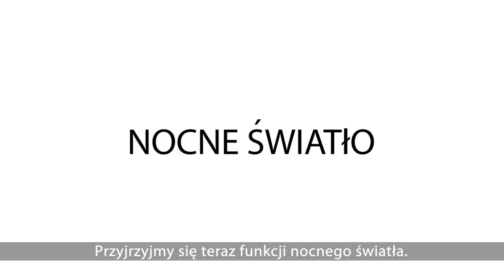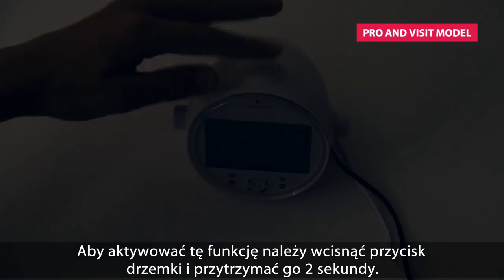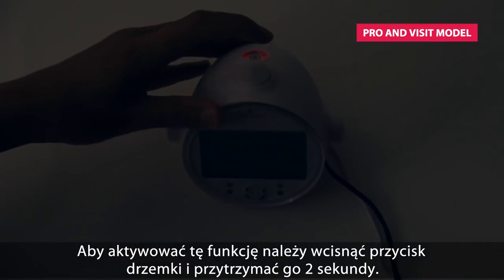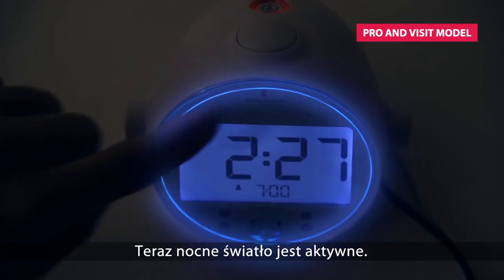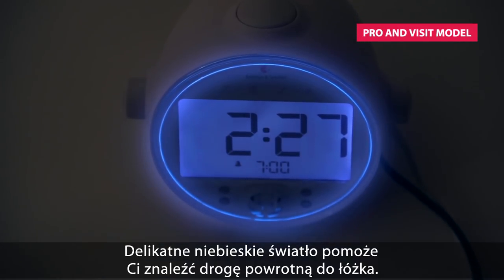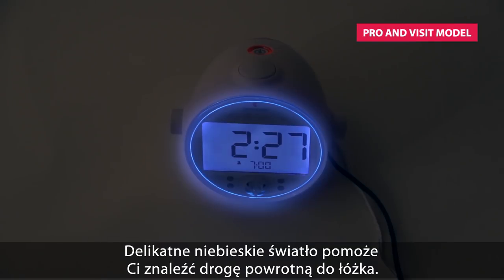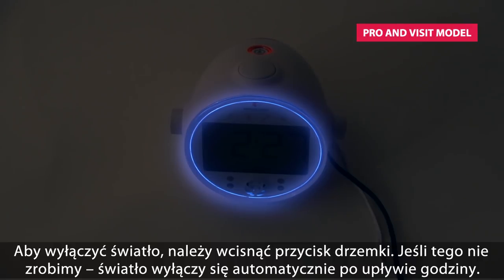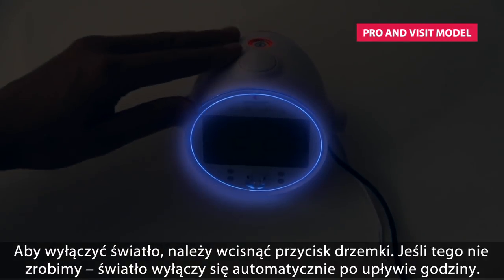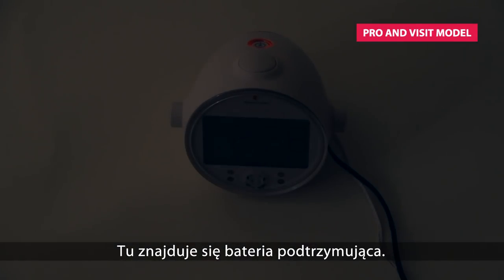Now let's have a look at the built-in nightlight beacon. To activate the nightlight, press and hold down the snooze button for two seconds. As you can see, it is now turned on. The gentle blue light will guide you back to bed without disturbing a living soul. To turn off the nightlight, just press the snooze button. If you leave it on, it will go out automatically after one hour.